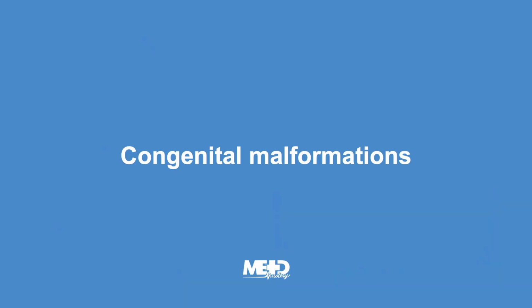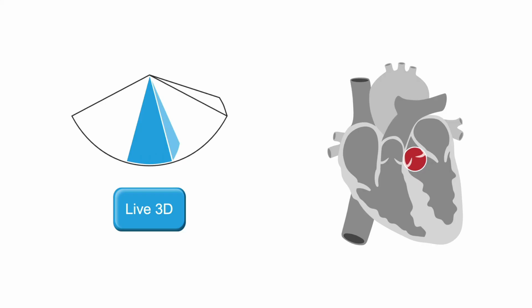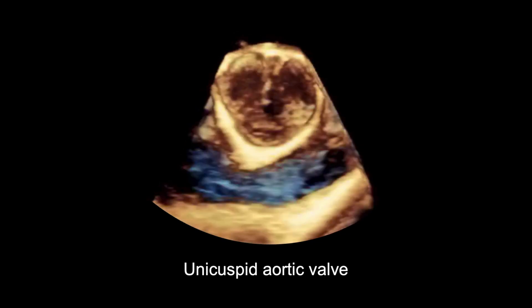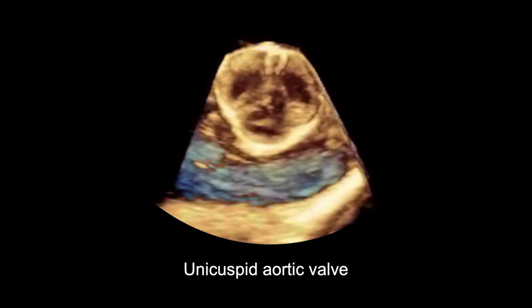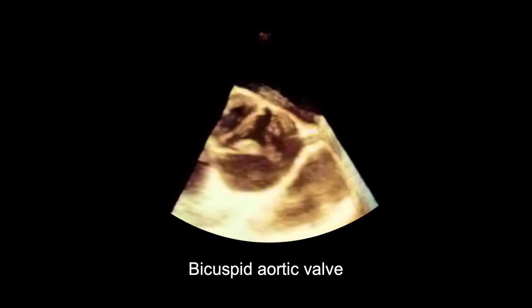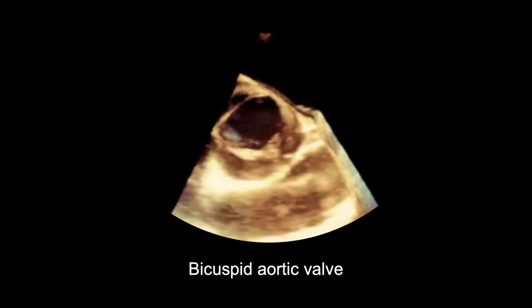Congenital malformations are valve defects that patients are born with. Live 3D views of the aortic valve can be used to visualize congenital malformations, such as a unicuspid or bicuspid aortic valve. Here you can see 3D echo of a unicuspid aortic valve. Here you can see 3D echo of a bicuspid aortic valve.